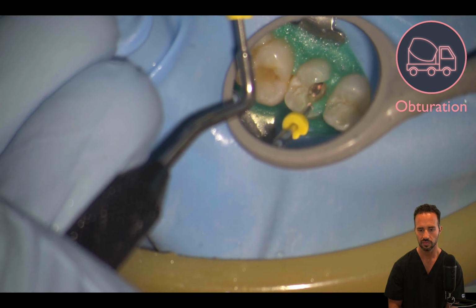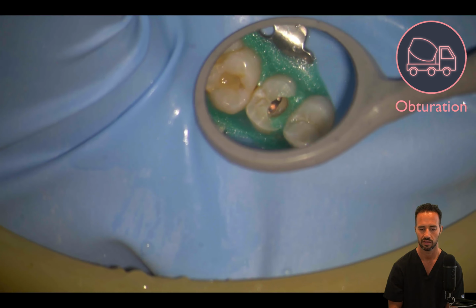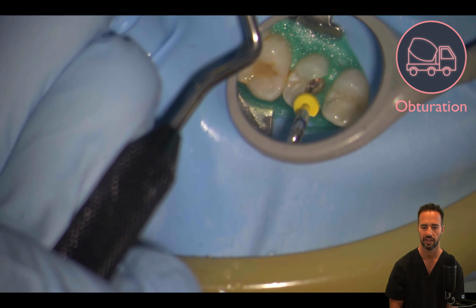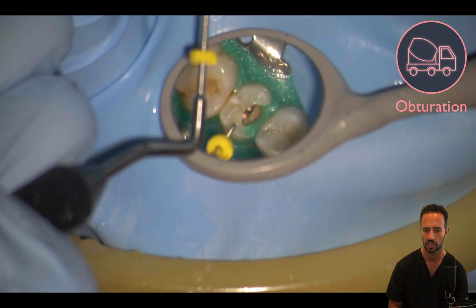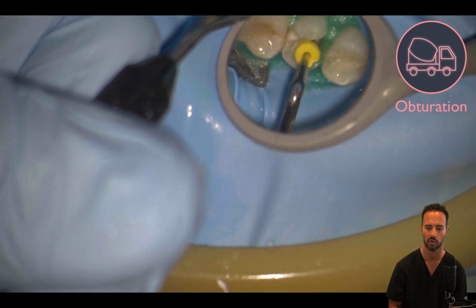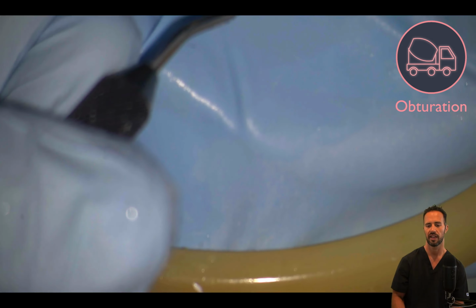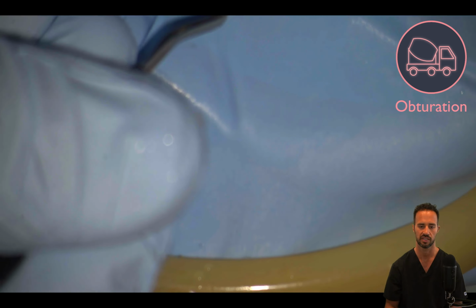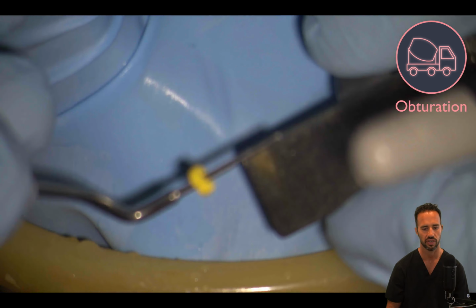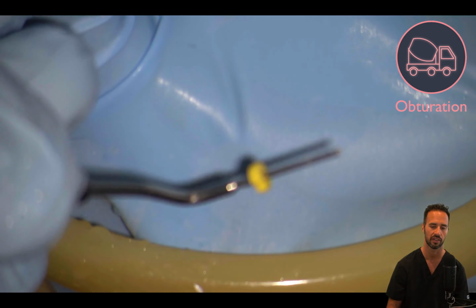And you can see that there to length. And I just found a little gutta percha there on the buccal that I want to just remove. And then we're going to go ahead and measure our post space here in just a moment to make sure it's at the length that's appropriate. And you can see that that goes all the way down. The post space was measured and found to be 11 millimeters in this case. And so I'm just seating that to 11 millimeters and then measuring it just to ensure it's the appropriate depth for the referring dentist.